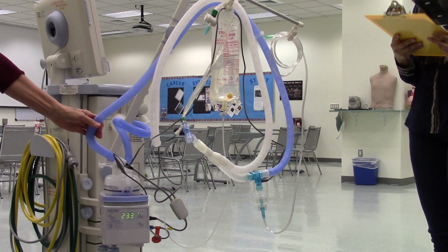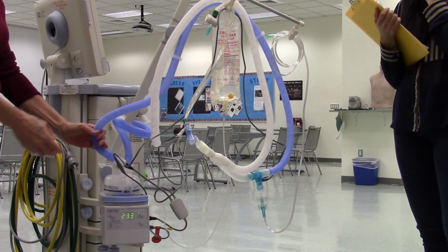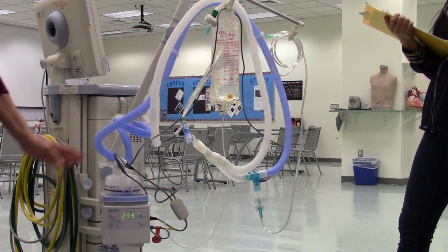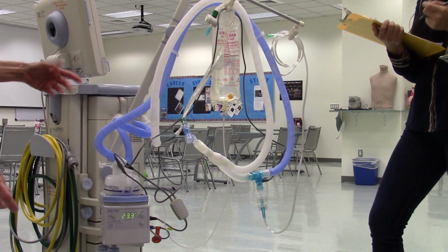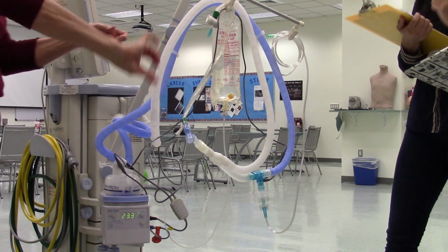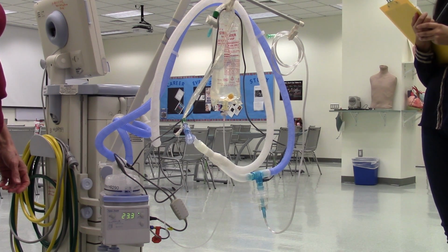But the rain out you throw away? That is the rain out. Any of the condensation, the cup? If it's coming from the rain out, throw that away. Because that's the exhalation, right? There could be a water trap added on the inspiratory side and on the expiratory side, so both. You just unscrew them and dump them in the garbage. It says, if an alarm is heard, what should you do?